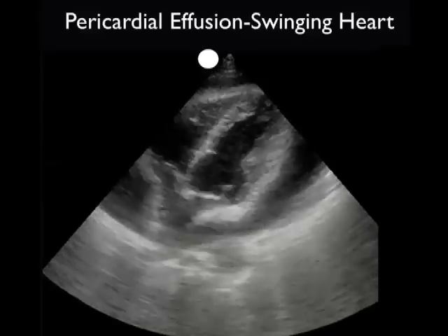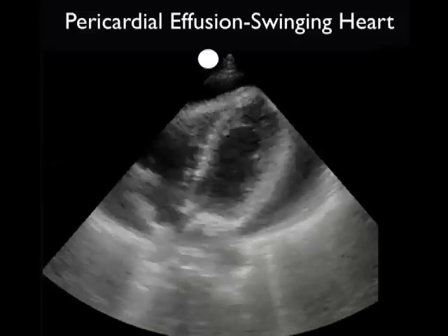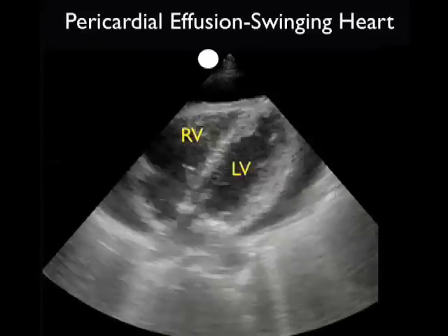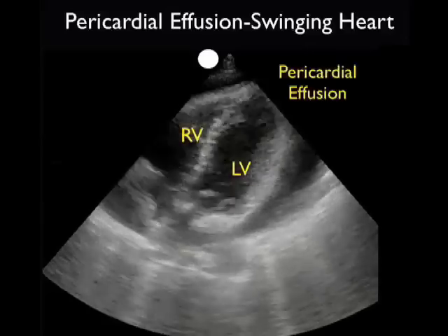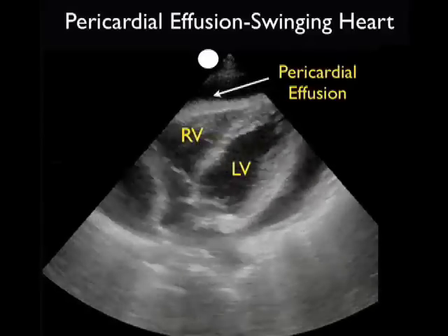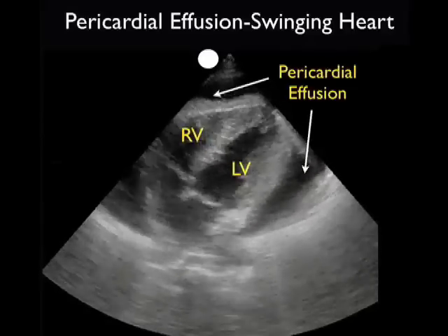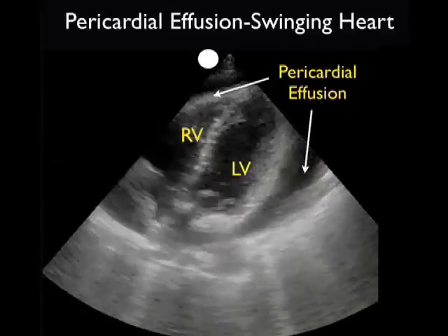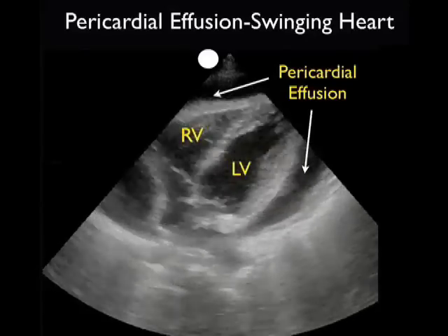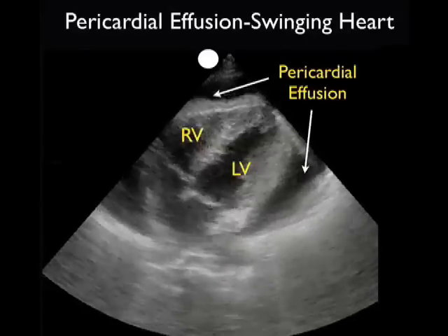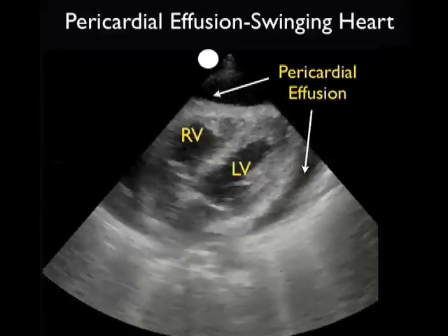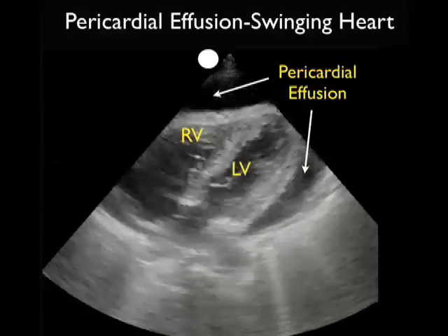Here's an interesting video clip of a patient who presented with acute shortness of breath. What we notice here is the right ventricle and the left ventricle closest to the screen, but we see a very large pericardial effusion circumferentially surrounding the heart. Notice the heart swinging back and forth in all the pericardial effusion. This gives rise to the phenomenon known as electrical alternans, or different-sized QRS complexes on the EKG.